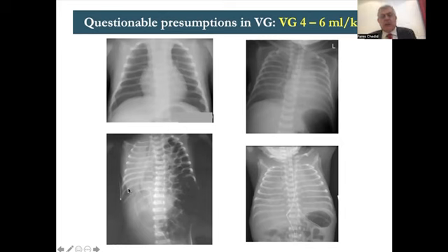So this patient will be harmed by even 4 or 5 mil/kg. The same for RDS of prematurity, you have different levels. RDS of prematurity stage 2 can take more volume than RDS stage 3 or 4, where we see quite a white lung. So it is a wrong presumption to say 4 mil/kg fits all. That's wrong.